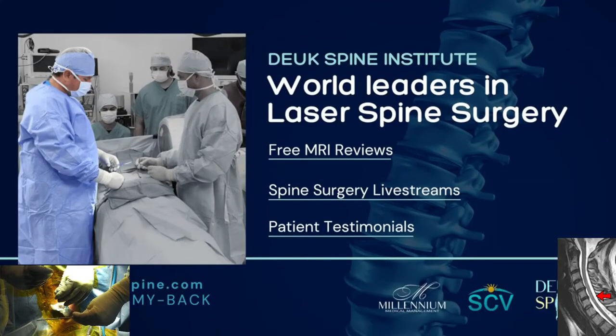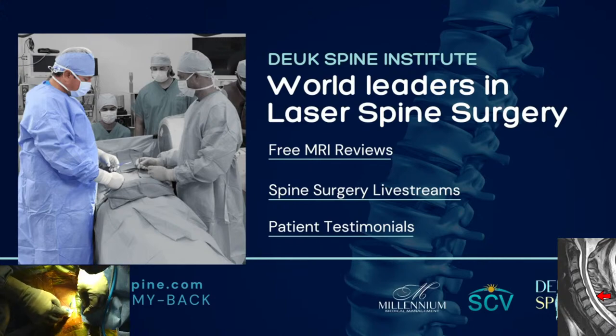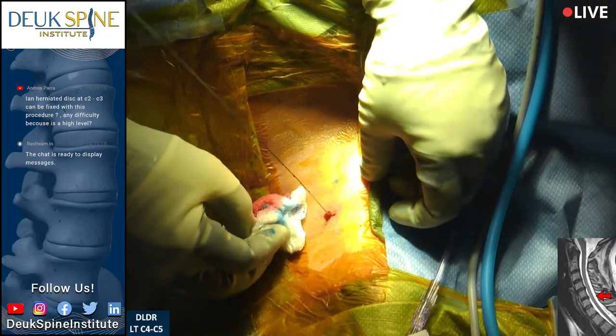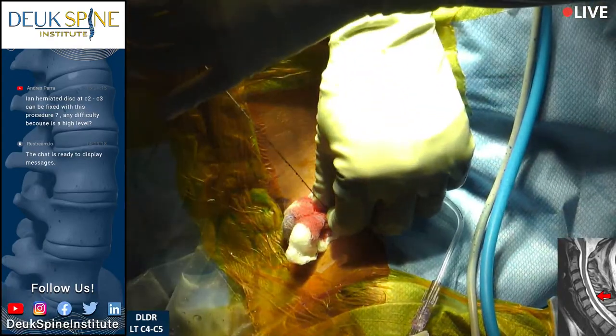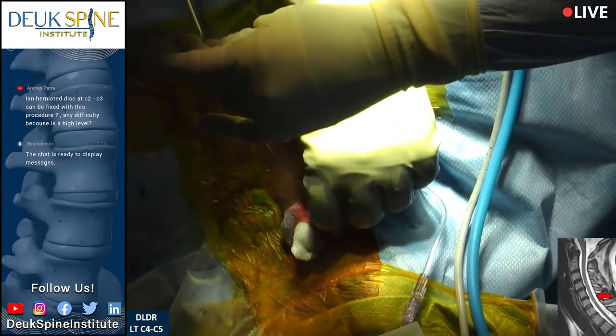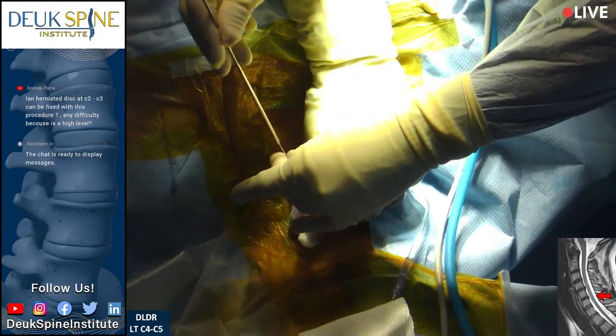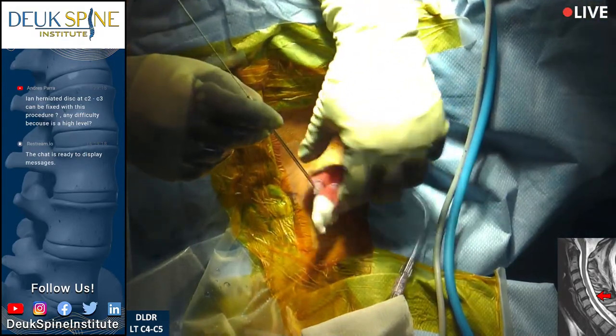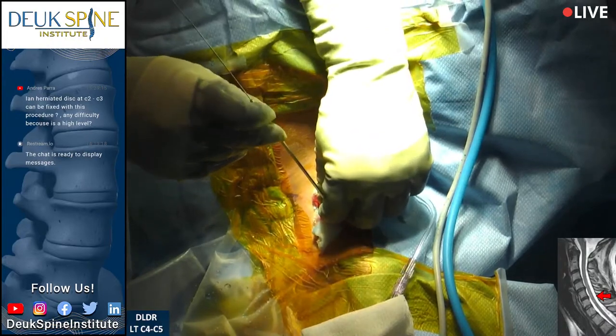If you have a herniated or bulging disc and neck pain, submit your MRI for a free review at www.mri.dukespine.com. We put a little pressure on the vein and it's stopped about 80%. At this point we're going to bring the dilator down from the outside world, through the neck and down to the spine.